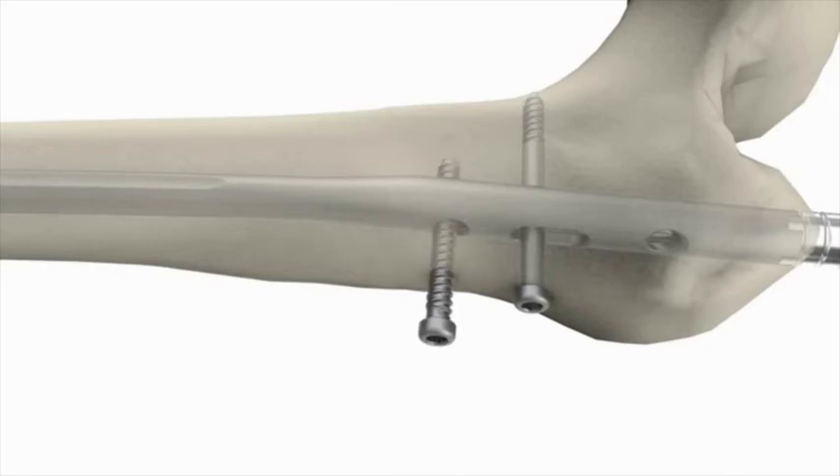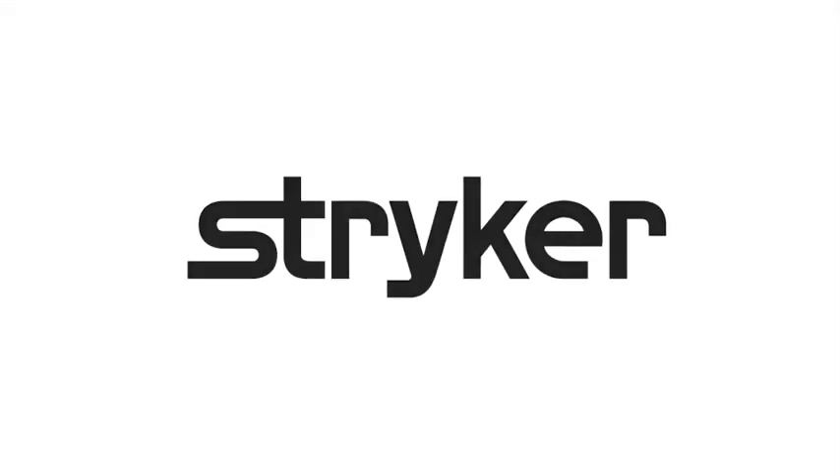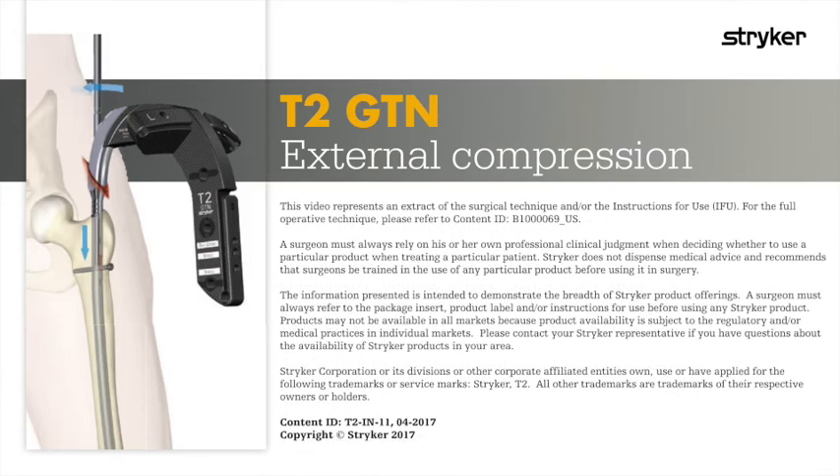After inserting the second locking screw into the static hole, the external compression device may be removed. Then, place the boot.